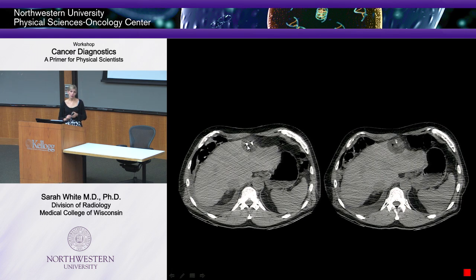And the beautiful thing about cryoablation is that you can see the ice ball form because it looks different. Okay, microwave, you can't see those microwaves. It doesn't make the tissue look different. So the 2 advantages to doing cryo is 1, it wasn't going to hurt him, and 2, I could see the ice ball forming. So I would know if I was encroaching on those muscles, okay? And here, this is when the probes are in, the ice ball is forming. And here is after I've taken the probes out.